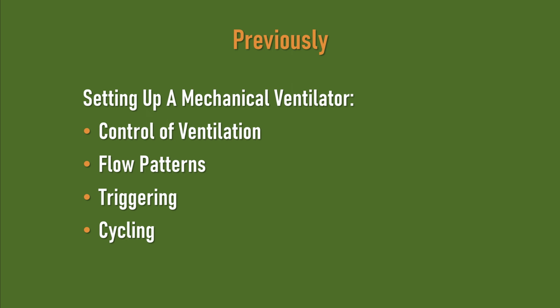We looked at triggering, how the ventilator knows it's time to give a breath. And we found that this was achieved usually by time triggering, but there's also negative pressure triggering and flow-by. And flow-by triggering is now the standard mode of the patient interacting initially with the ventilator. Finally, we looked at cycling, how the ventilator knows it's time to go to expiration. This can be achieved, and it usually is in control modes, by time cycling, but the ventilator can also volume cycle or pressure cycle, and in specific situations such as pressure support, the ventilator can flow cycle.